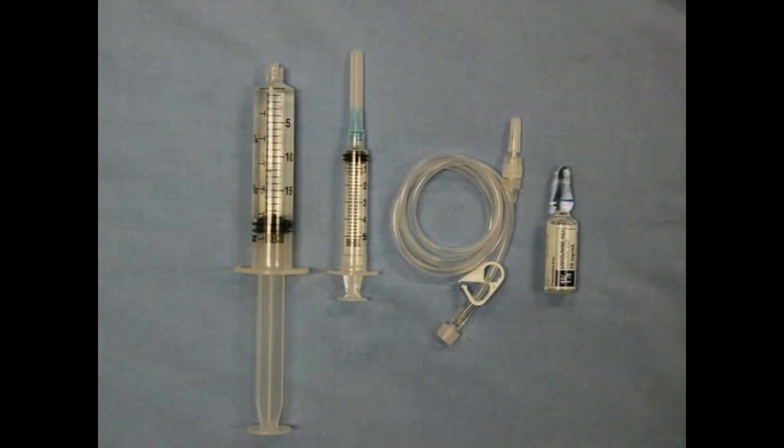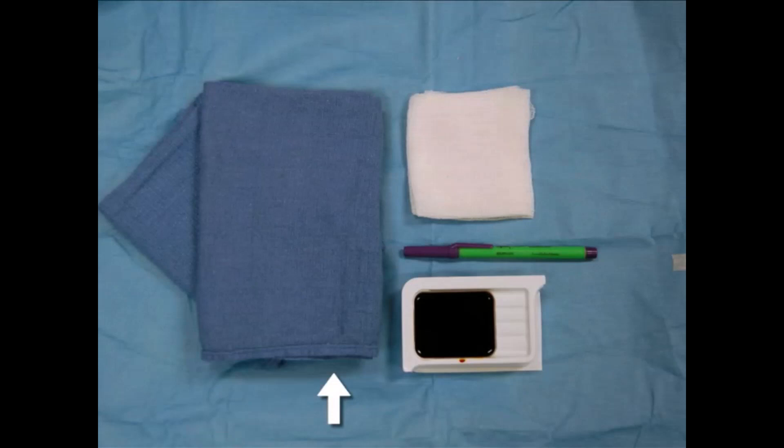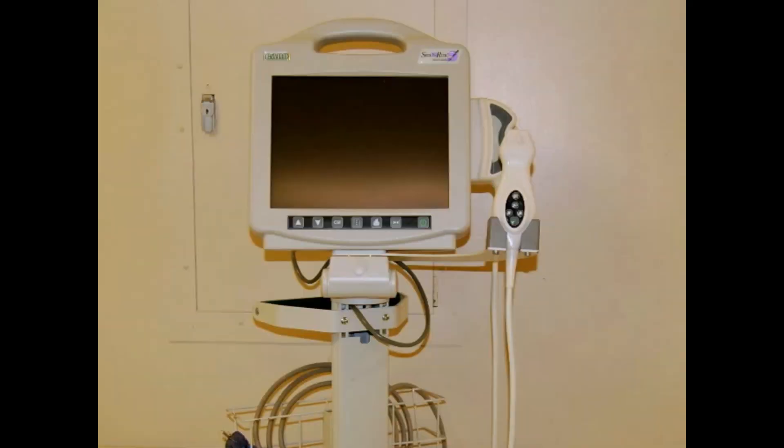Lay out the necessary equipment prior to beginning the procedure: a 20-milliliter syringe, a 5-milliliter syringe with 25-gauge needle, sterile IV tubing, and 1% lidocaine. Should you choose to confirm needle placement by nerve stimulation, you will need a nerve stimulator, an electrode, and a 22-gauge, 120-millimeter insulated stimulating needle. In addition, you will need sterile surgical towels, sterile prep solution, sponges, gauze, and a marking pen. An ultrasound machine with a low-frequency transducer will be required, along with sterile ultrasound gel and a sterile sheath.